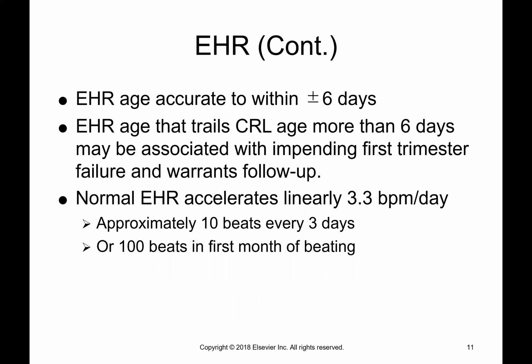Now I do see the normal fetal heart rate accelerate up to 170, 180 in a normal fetus around 7 to 8 weeks, and then it seems to drop. If you do scan an embryo that is 5 weeks, 6 days, or 5 weeks, 5 days, maybe 5 weeks, 4 days, the heart rate could have just started, and you'll get a lower heart rate around 100 beats per minute, but it should start accelerating throughout the first month.